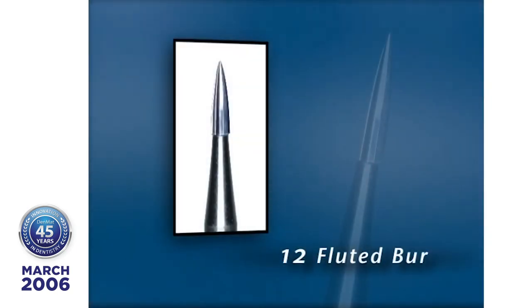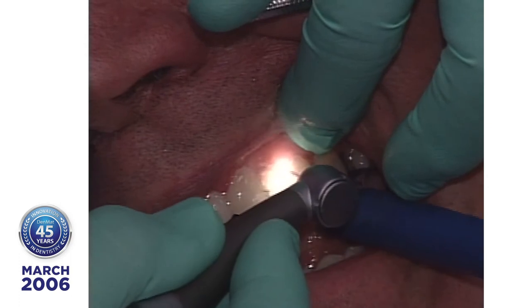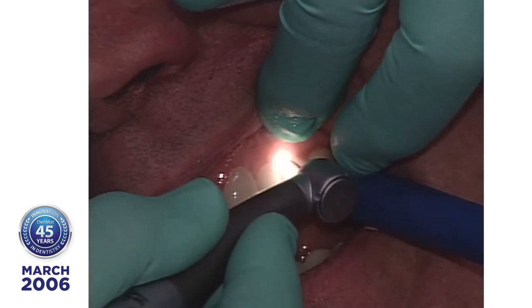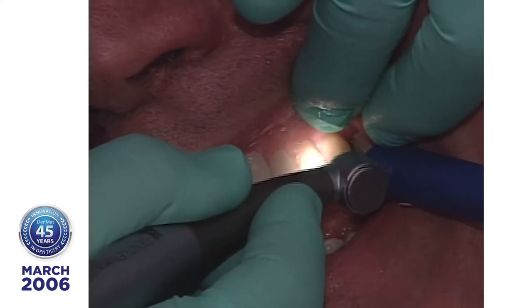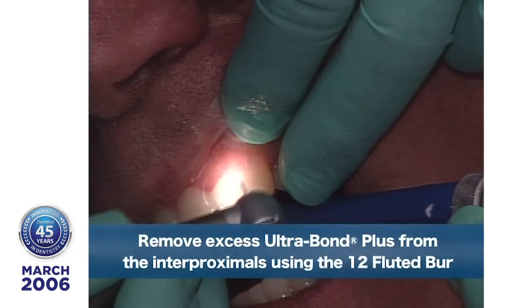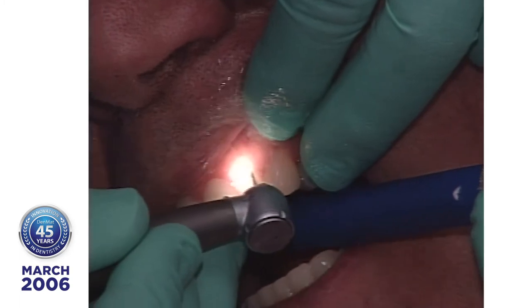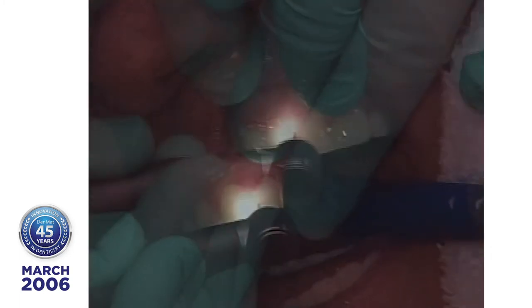Now we're going into the stage of finishing. Remember, we did surface preparation and bonding. And what we're doing is taking off the Ultrabond. Now, this won't take off the porcelain. I mean, it'll take off the glaze and scratch it up if you're not careful. But I'm letting this be guided by the porcelain. And this just removes the Ultrabond that's on the interproximal embrasures. So all we're doing is bonding and putting on, and then we play takeaway.